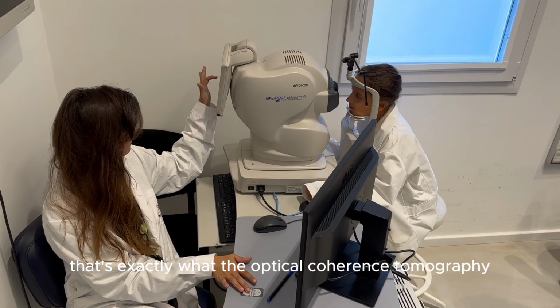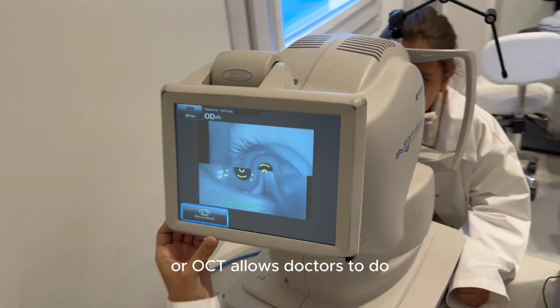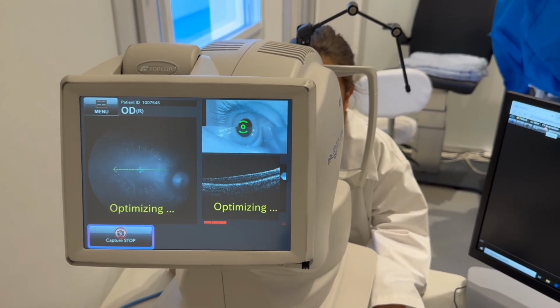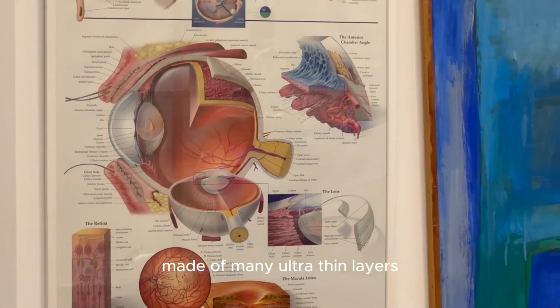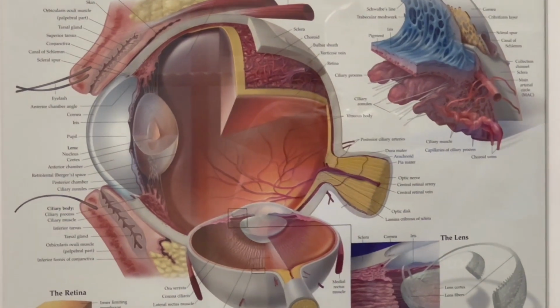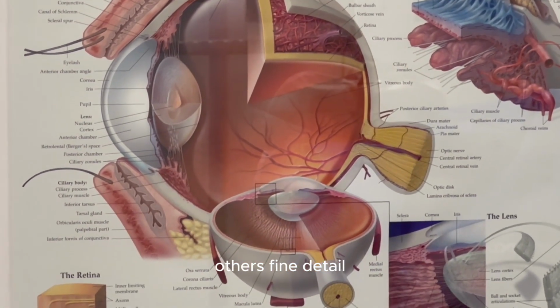Well, that's exactly what Optical Coherence Tomography, or OCT, allows doctors to do. Not with dessert, unfortunately, but with the eye. The retina is like a baklava, made of many ultra-thin layers, each with its own role. Some sense light, others color, others fine detail.